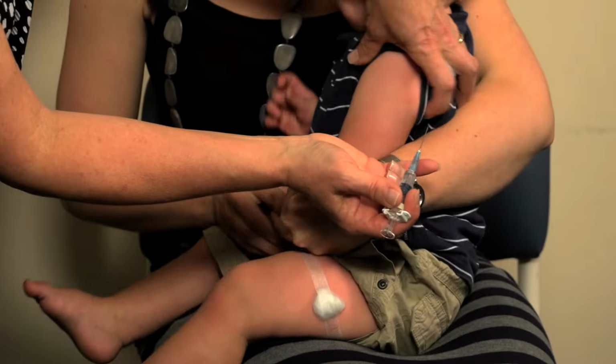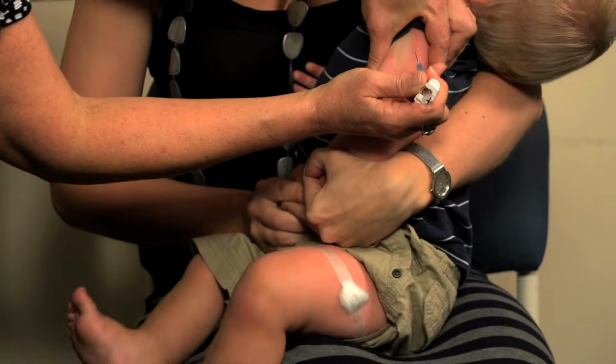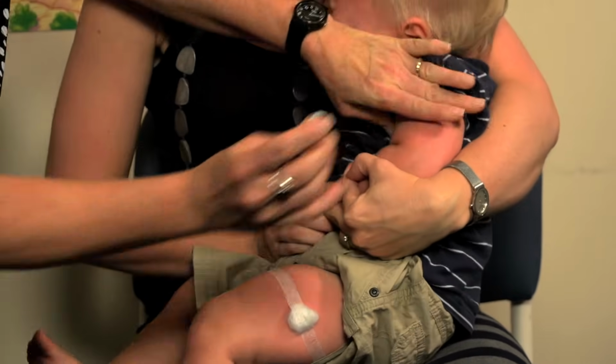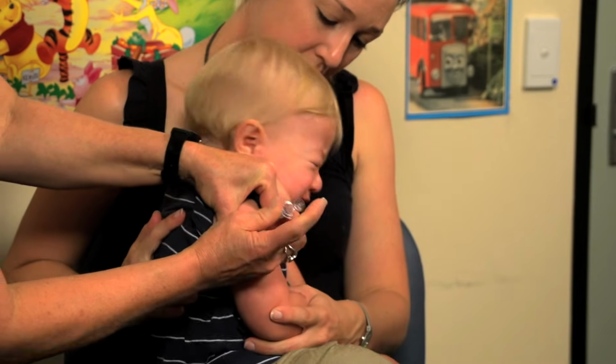Here is another example of a child receiving their 12-month vaccines. This child needs to be restrained securely. Note how mum is holding his hands to prevent them moving about. Again, the nurse pauses before administering the vaccine, waiting for the child to settle.